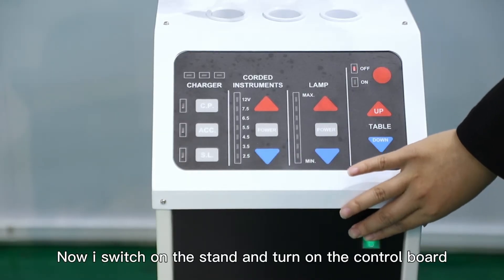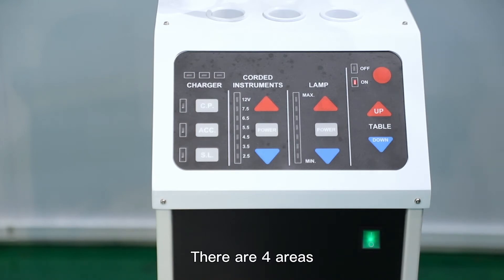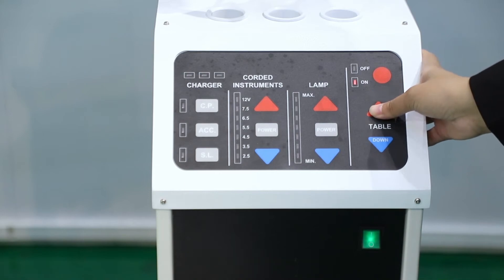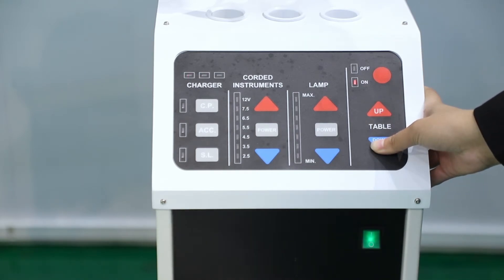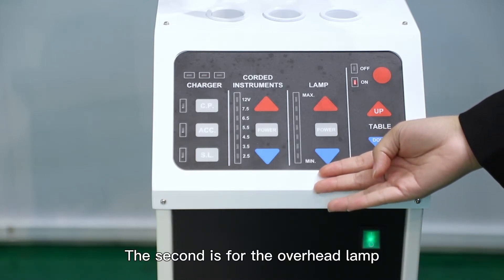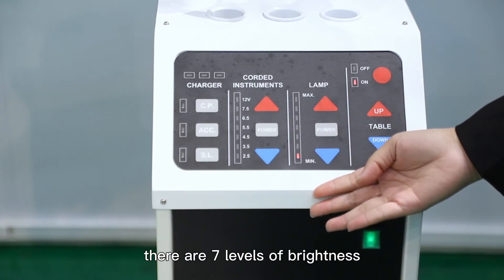Now I switch on the stand and turn on the control board. There are four areas. The first is to control the table up and down. The second is for the overhead lamp — power on. There are seven levels of brightness.